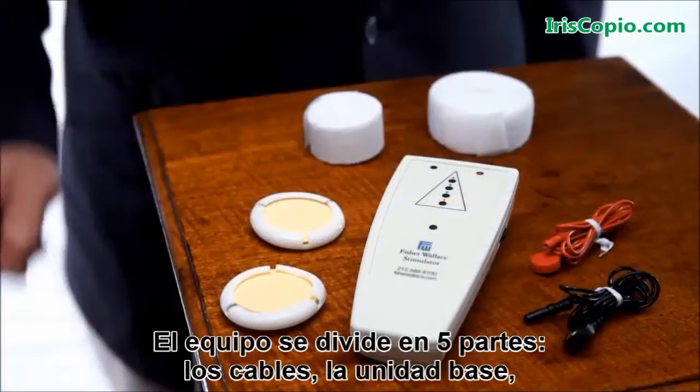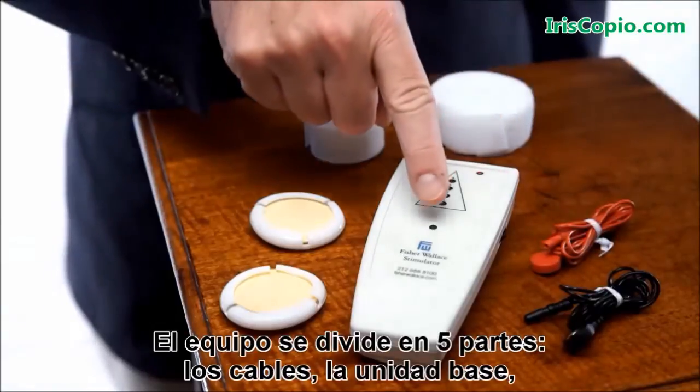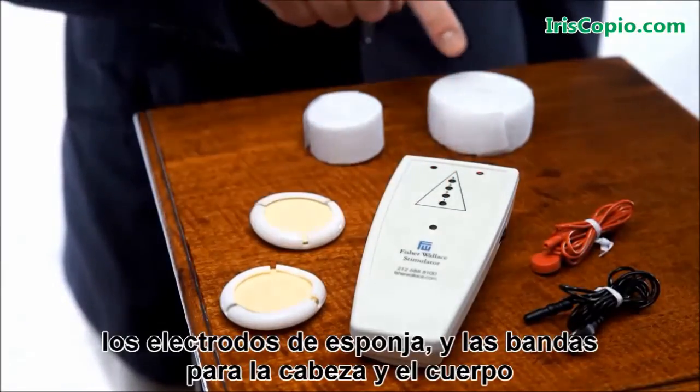The device comes in five parts: the wires, the base unit, the sponge applicators, the headband, and the body band.